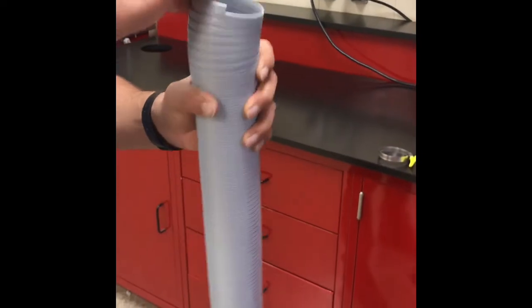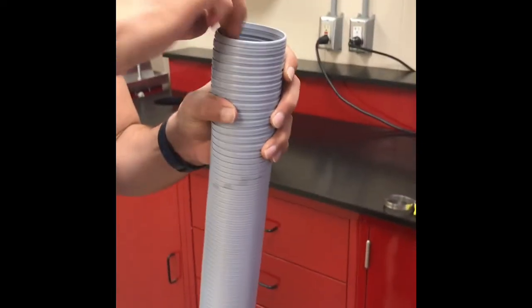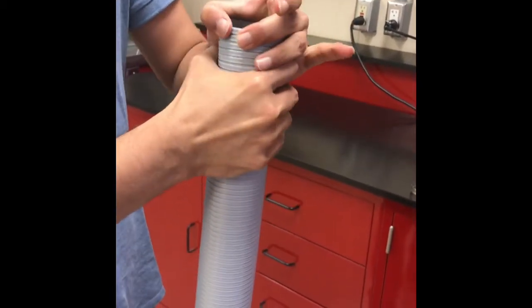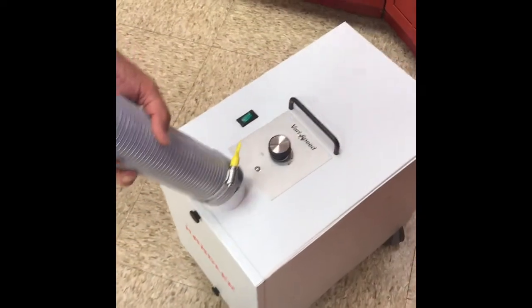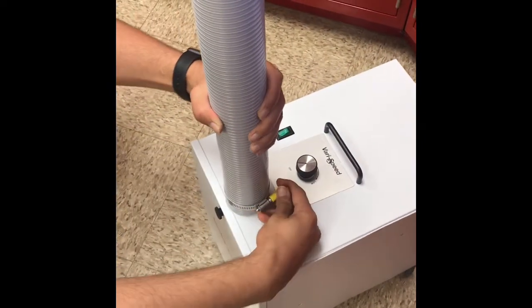We're going to expand the flexible hose at the end, and then tighten slightly, and then compress it again. Once you achieve a tight fit, you just slide the hose back over and tighten the clamp.